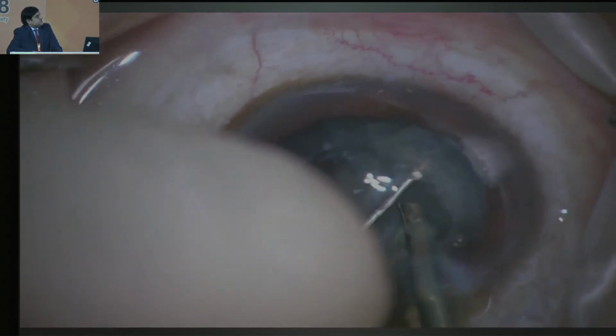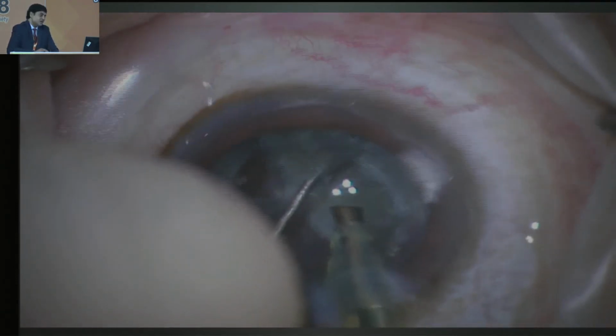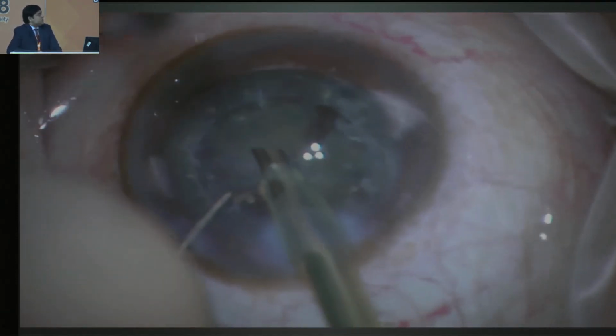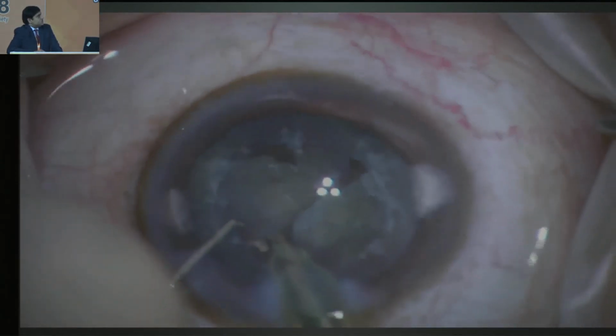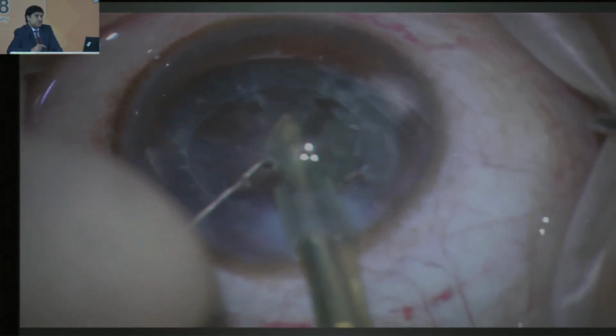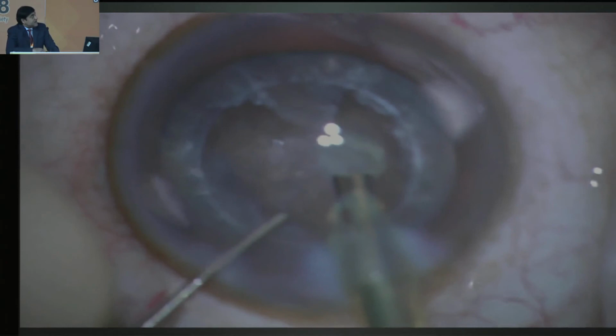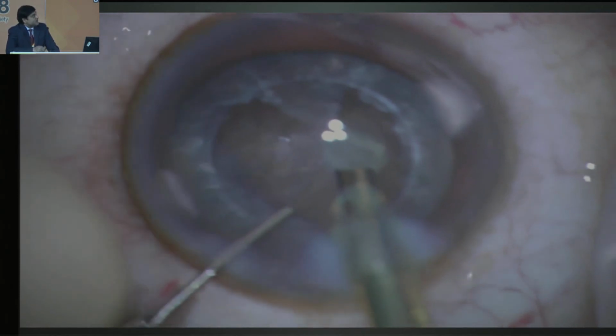And the second advantage of doing it this way is that you do not have a very large epinuclear sheet out in the periphery. If you don't segment, that is one of the disadvantages, like with the Lens X laser. If you just create the cylindrical pattern that we talked about previously, that leaves much more epinucleus for you to manage, whereas if you segment, you have just the thin sheet of epinucleus outside of where the posterior capsular plaque is located.